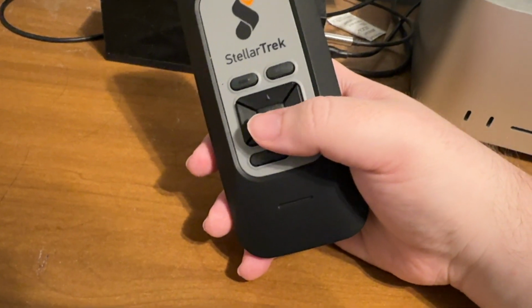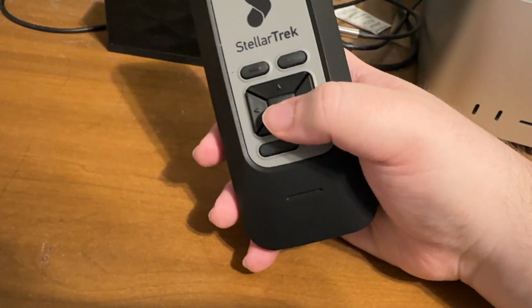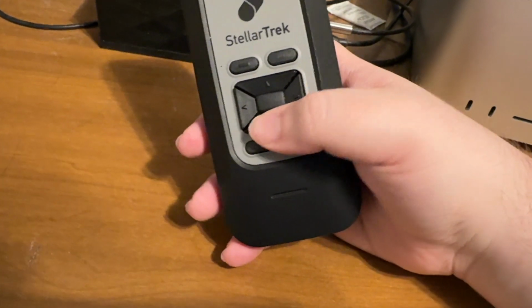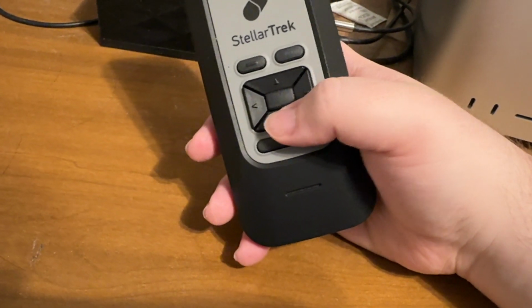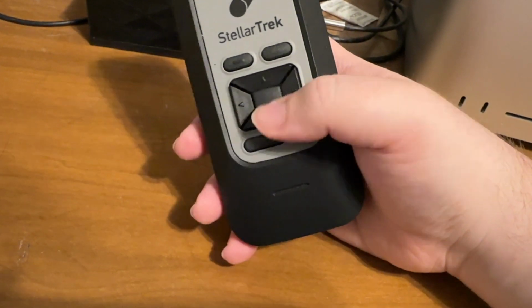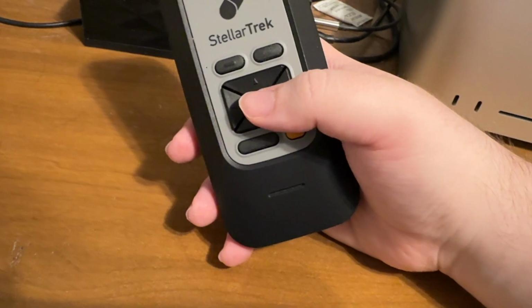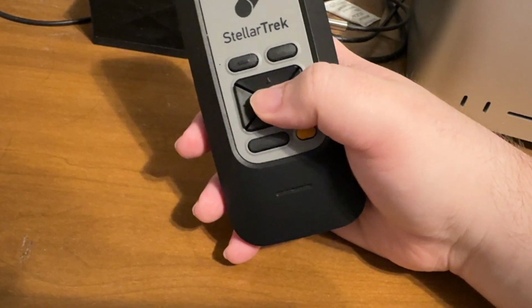Creation date. So right now, if we were to press confirm, we'd be on creation date. So let's press the down arrow. Proximity. Last used. City. Creation date. Press confirm to sort by proximity. Let's select proximity. I'll press confirm.